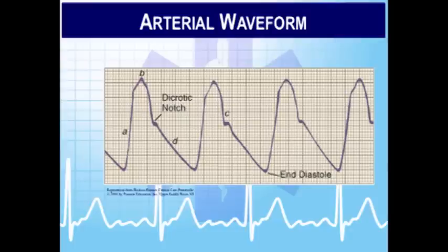And then we calculate a mean arterial pressure mathematically, very different than the way the monitor calculates a mean arterial pressure. So if you did it mathematically with your calculator and compared it to what you get on the monitor, it's going to be a little bit different. Don't get freaked out about that. It just does it a little bit differently.